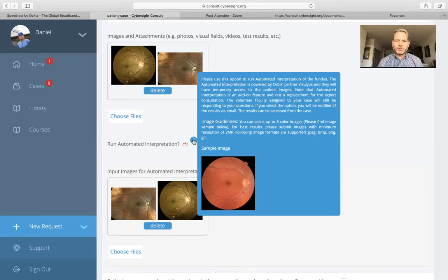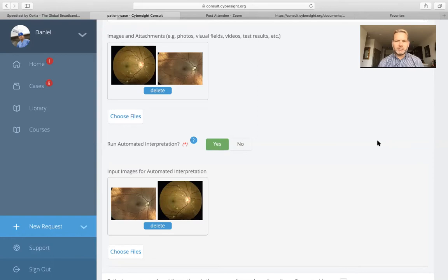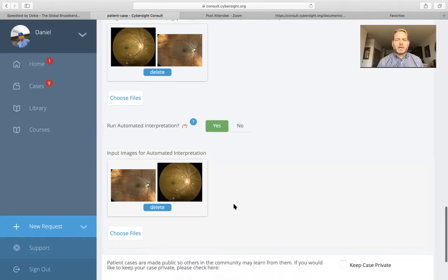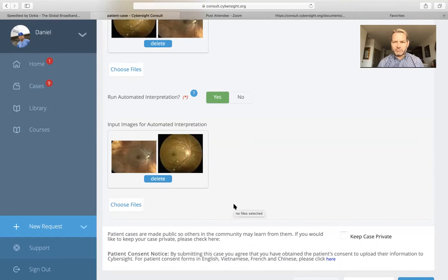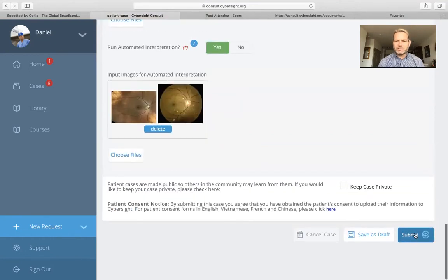Why would we use automated interpretation? Because normally, our turnaround time target for a mentor to get back to you is going to be 24 hours or less. While you're waiting on that detailed feedback from the mentor, you'll be able to get almost immediate feedback from the artificial intelligence. The AI system will begin to answer some of your questions, which the volunteer faculty member will then further expand upon. We've selected our AI interpretation images, and we'll go ahead and submit this case.